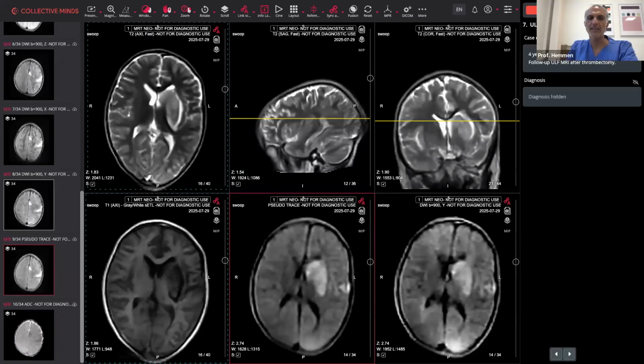Thank you very much, because this is, I think, very important because we see this often in quite a lot of cases. In the beginning, we were alerted, especially when we didn't know the clinical scenario so well. And the patient was intubated and we didn't know how he was performing. And then we found out by the time, as you say, that this is not a pathology that we can see here. Okay. So let's go to the question.